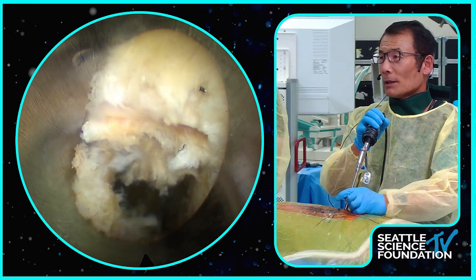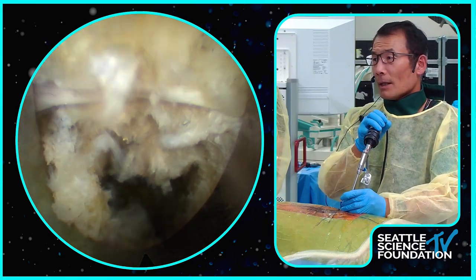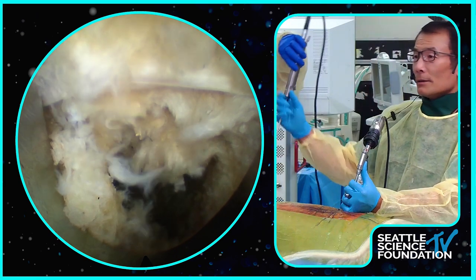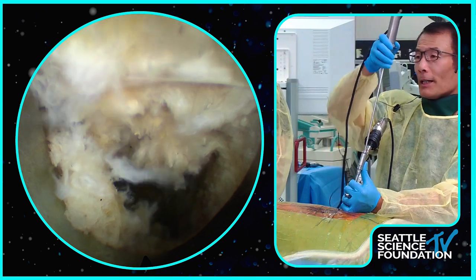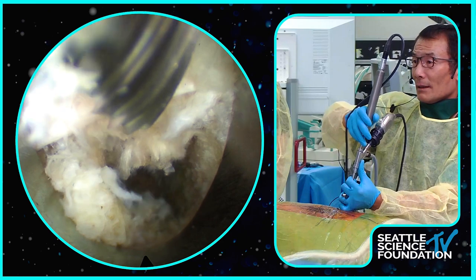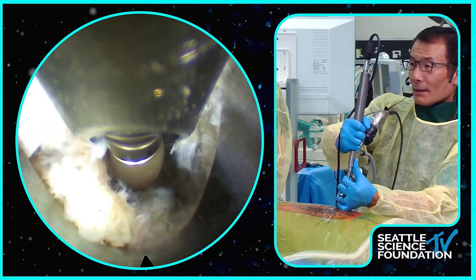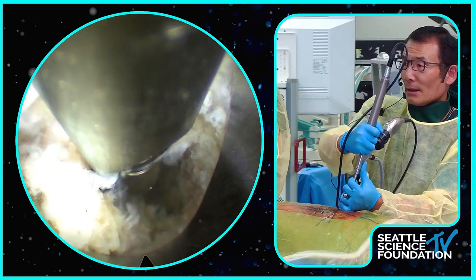You can also do it like this, okay? Can I have the drill? There's an overhanging end plate at L5. I can drill it off. Once again, the protected sleeve is against the nerve. You can actually use this drill for your discectomy.